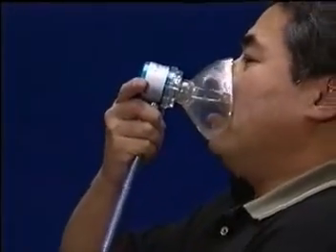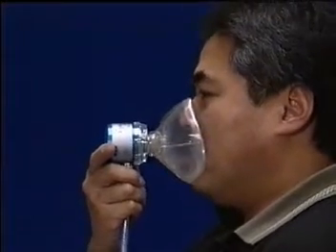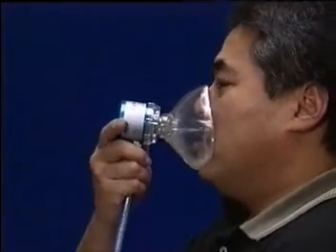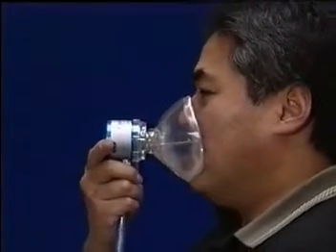In order to initiate demand flow, you must ensure that the patient has a positive mask-to-face seal. This will ensure that the patient receives the full volume of analgesic gas they require.